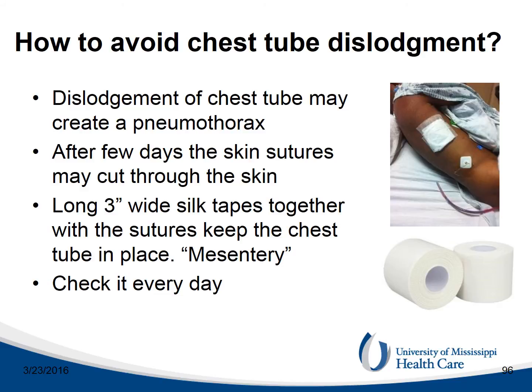Contrary to common belief, the skin suture at the base of the chest tube does not reliably hold the chest tube in place, since, after a few days, it tends to cut through the skin due to tension and ischemia of the skin. The picture shows a chest tube lying in the bed outside the patient who developed a pneumothorax. Therefore, we rely on a large tape to hold the chest tube in place.